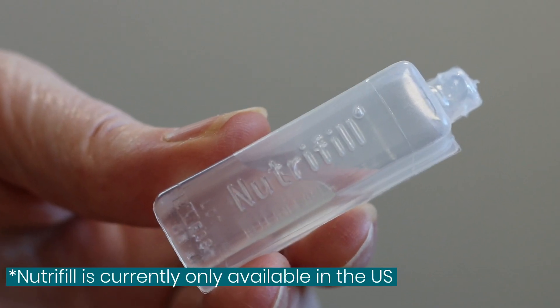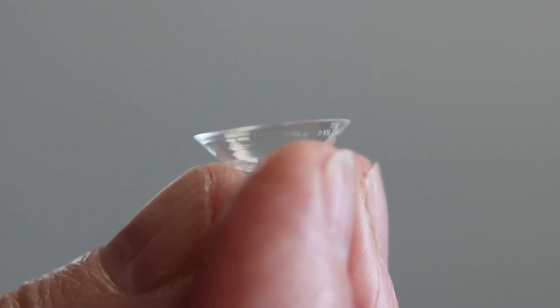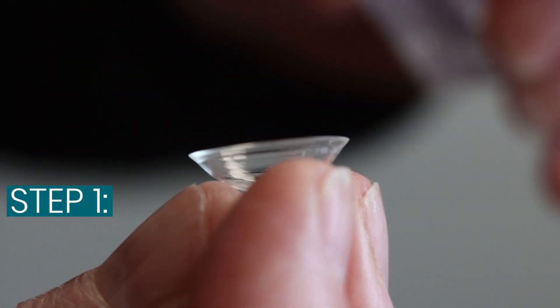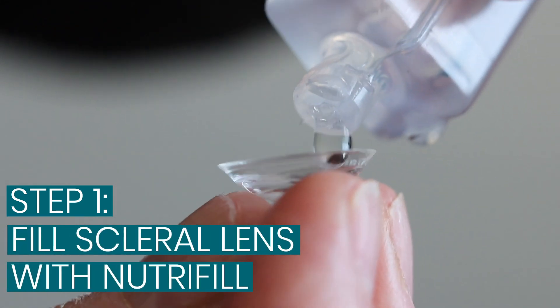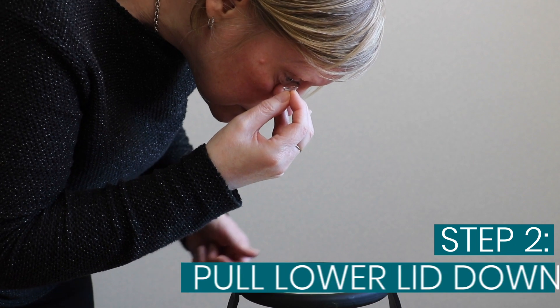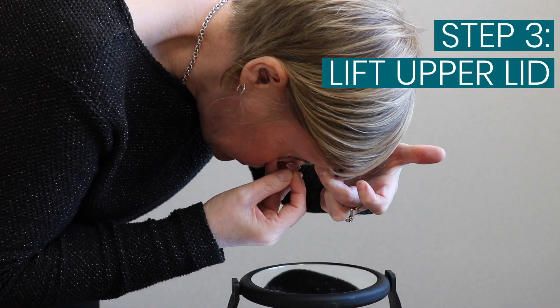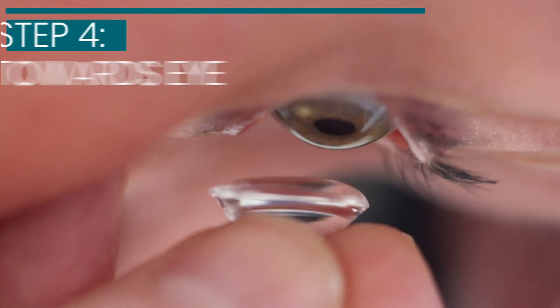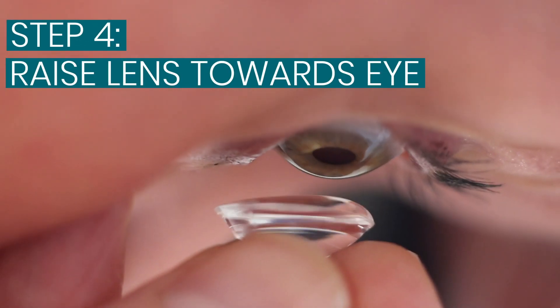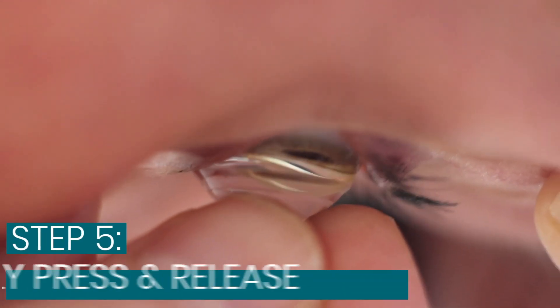We'll be using Nutrifill scleral insertion solution for these demonstrations. First, fill the bowl of the lens with Nutrifill, lower the bottom lid, lifting the top lid, and then gently lifting the lens up. Be prepared for a cold sensation as the solution touches the eye, and then gently but firmly push the lens onto the eye and remove.